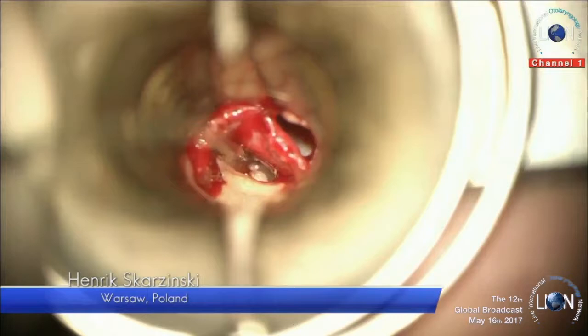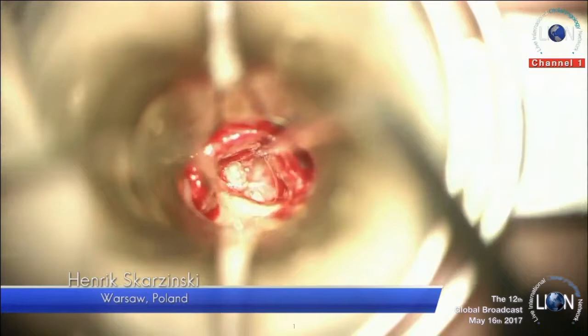The patient was not visiting any ENT. Some visits at the GP with regular otoscopy where there was not any claim that there was a retraction pocket. And you can see we have two issues. The first is there is no connection between the long process of the incus and the head of the stapes. Now we can see the head of the stapes. Additionally, the position of the long process of the incus is a little bit not classical — it's a little bit curved.